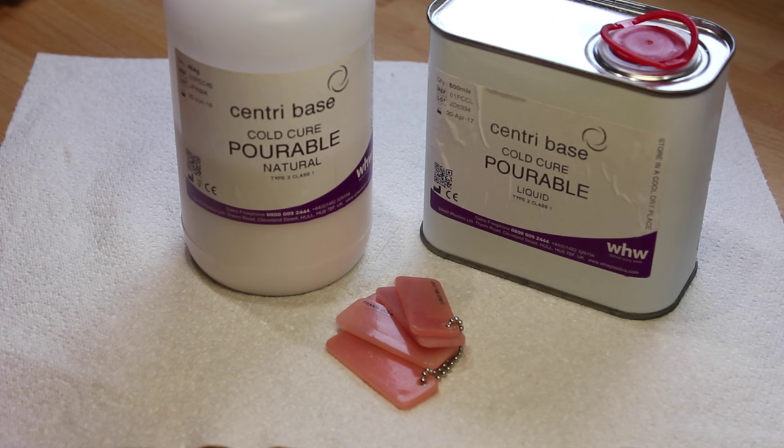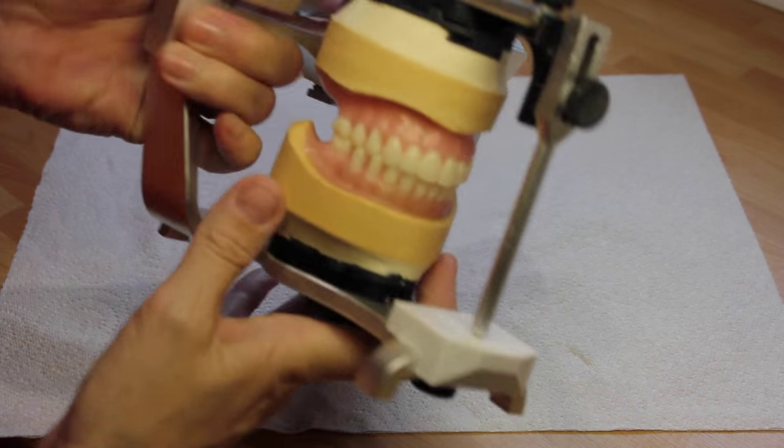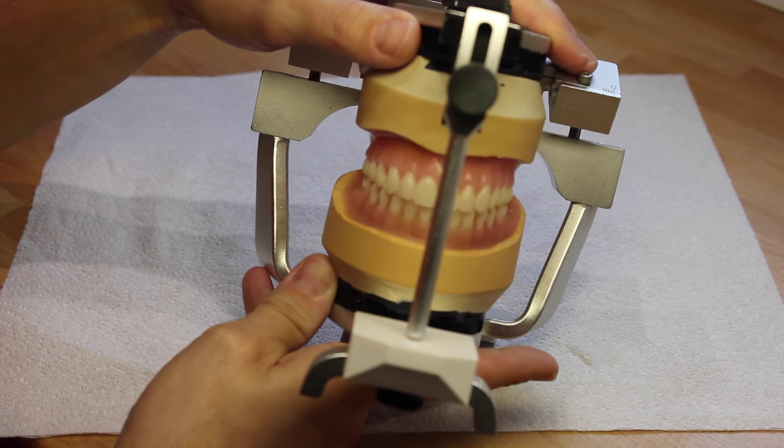Welcome to this instructional video from WHW. Today we will be covering the use of Centri Base cold cure pourable acrylic. I will use this complete full denture wax up to demonstrate how quick, clean and easy this system is.